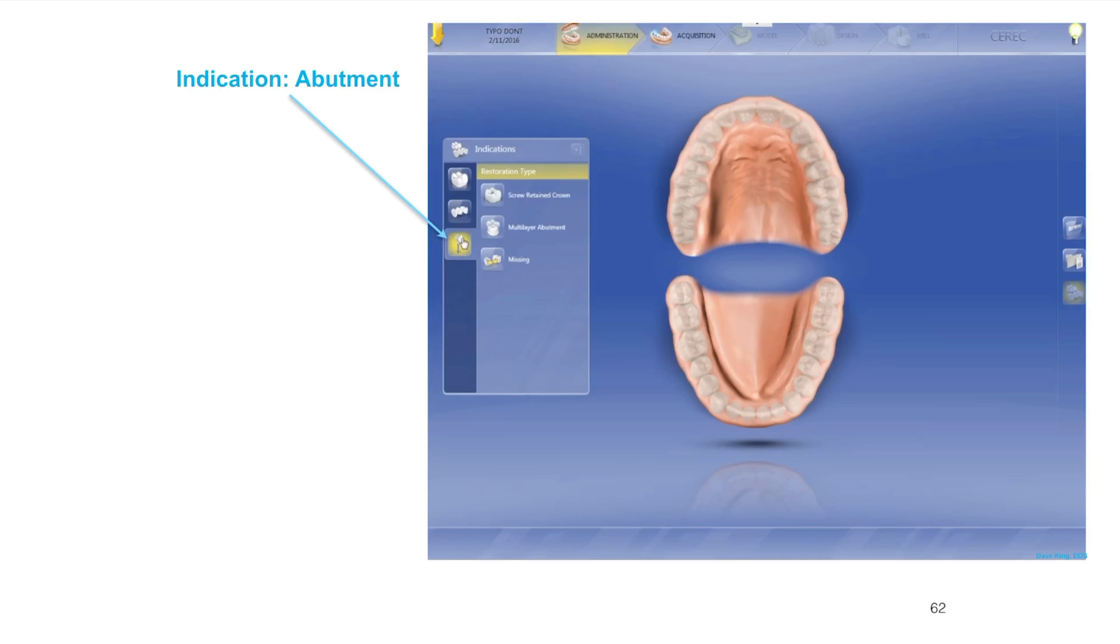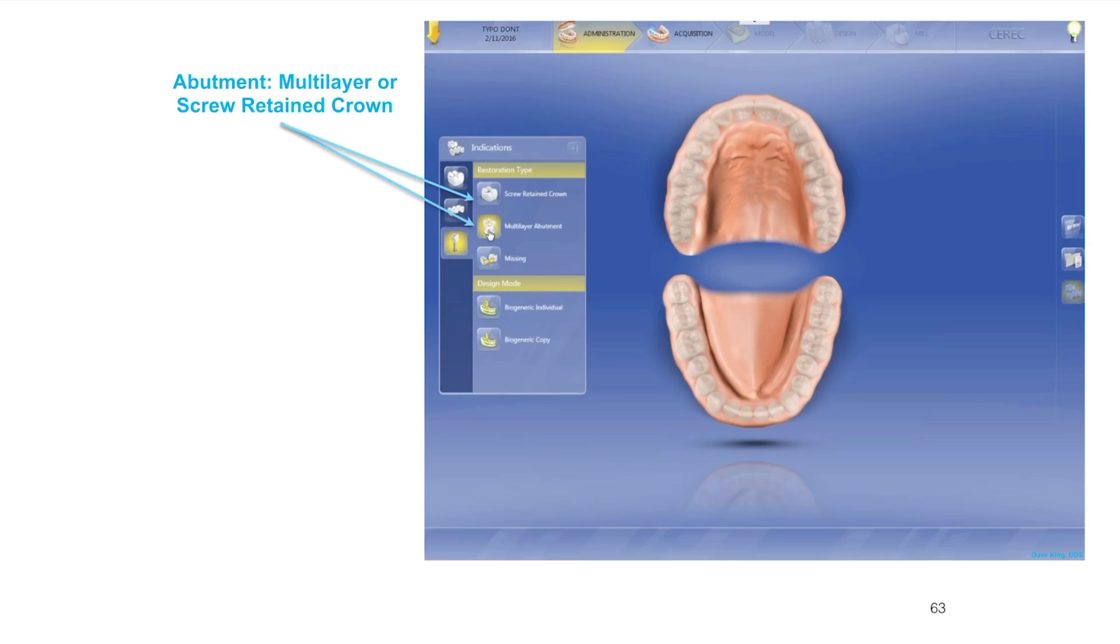You can add a case or add a new patient. I like to just add a case so you don't have too many patients. Search for the patient's name and pull up that patient. We're going to select abutment. You've got single tooth, multiple teeth bridge, and then the abutment choice. First step is selecting the abutment as the indication.